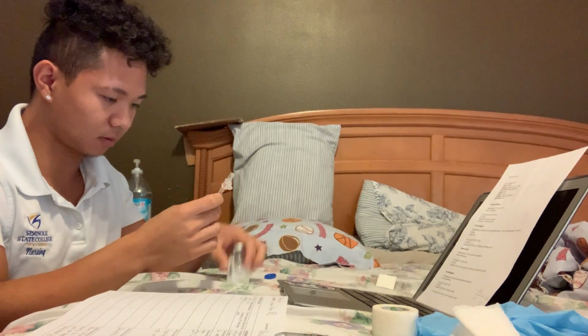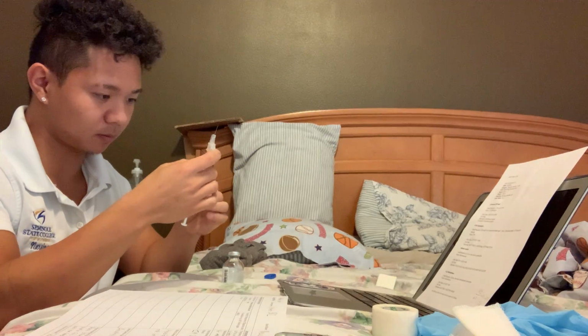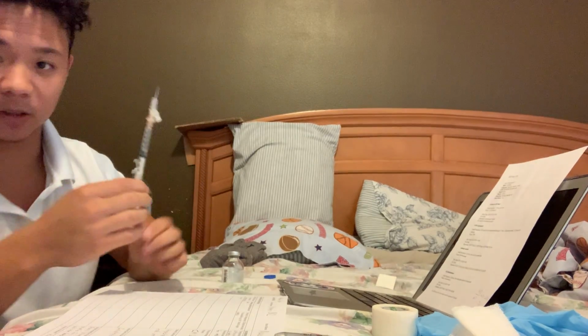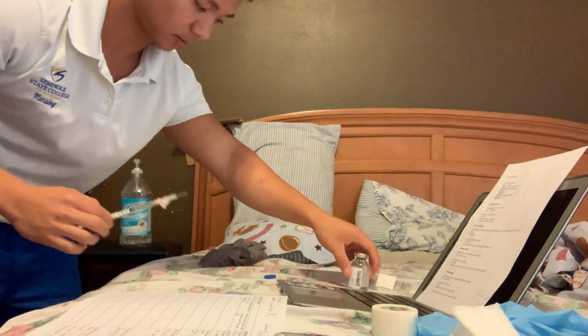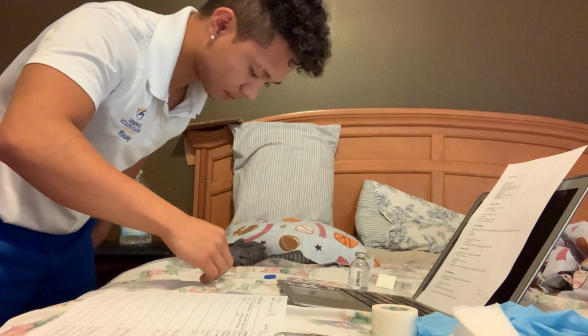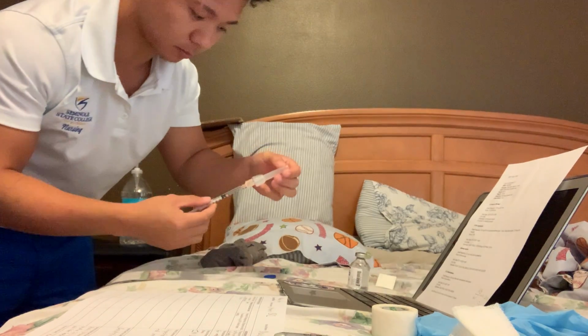Gonna tap out any bubbles. As you can see, I have 0.5 milliliters of the medication, and I'm gonna safely recap it using the scoop method.